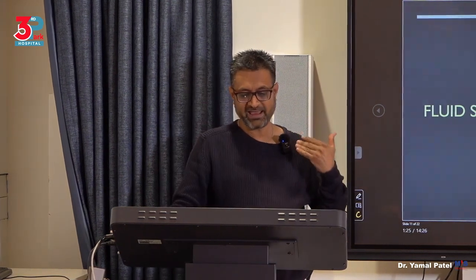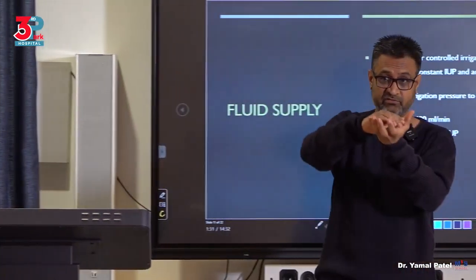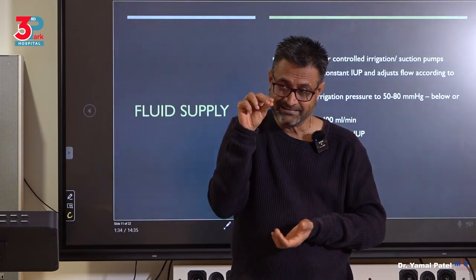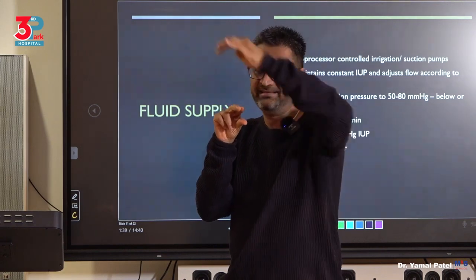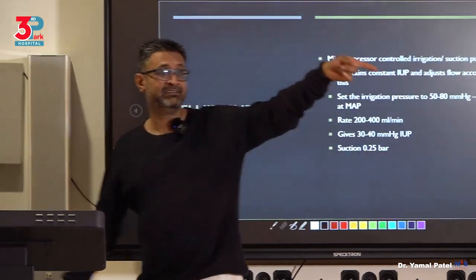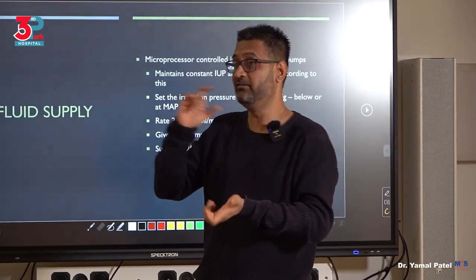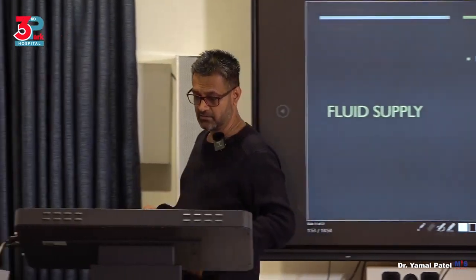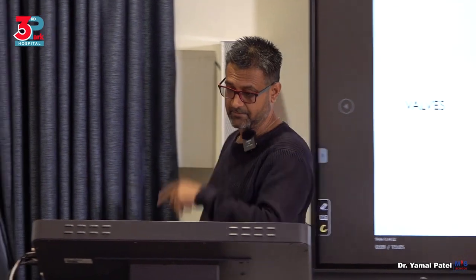So you should try aiming at 30 to 40 millimeters of mercury intrauterine pressure to give you a good distension. So remember the internal os and then the ostium. So 40 to 70. If you keep it between there, that's what this pressure will do. When you say I'm setting it at 100, it doesn't mean it's giving you 100, but it's going to keep it below 100. It's the maximum. You've understood? So this is what you will be setting at. So these are the valves I was talking about. The external os, the internal os, the ostium, and the fimbrial end, right?